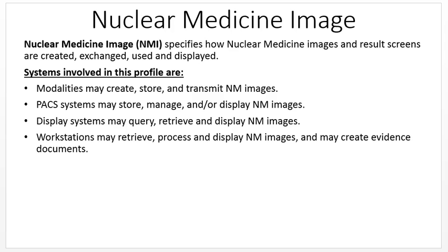So our first profile is nuclear medicine image. Remember that profiles are created to help solve common problems. There isn't a profile for every modality because most of them are pretty simple to create, store, and retrieve. Nuclear medicine, however, is not. There are a lot of post-processing software systems for nucmed images, so this profile was created to help all the nucmed systems get on the same page.